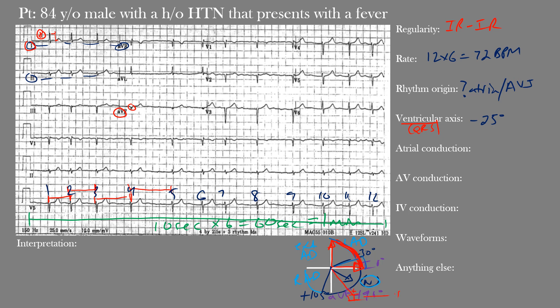Lead II sits at positive 60 degrees, and its perpendicular plane passes through negative 30 degrees. If lead II is mostly positive, the axis is in the more normal range; if negative in lead II, it falls in the pathological region. In this case, the QRS complexes in lead II actually appear isoelectric — the positive and negative portions are roughly equal — meaning our axis lies right along the negative 30-degree boundary. The axis was confirmed at negative 25 degrees, still within normal limits but in the leftward portion.